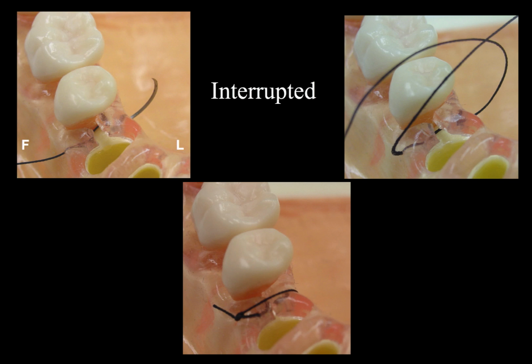Here in the photos, you can see the actual steps for placement. First, in the left panel, you can see the suture is started on the facial side, where the suture needle is passed through the facial flap, through the interproximal space, picking up the lingual flap from the underside, and then exiting on the lingual surface. Next, in the right panel, you can see the suture is then placed around and then threaded through the interproximal contact and then ultimately tied on the facial side. This is the interrupted suture technique.